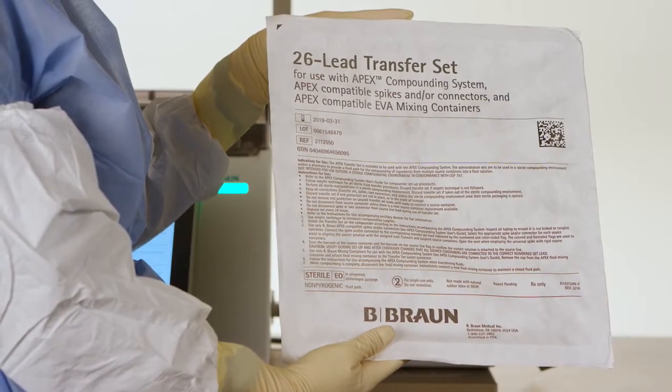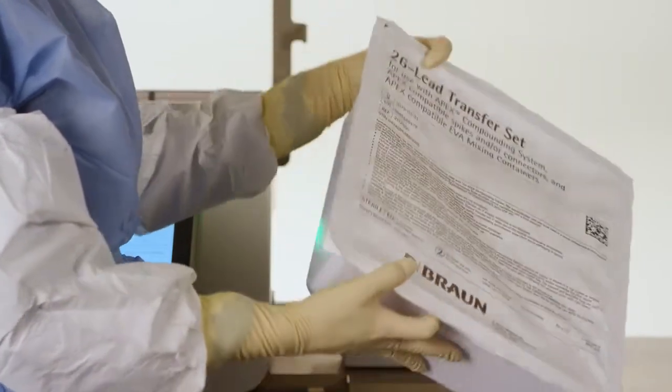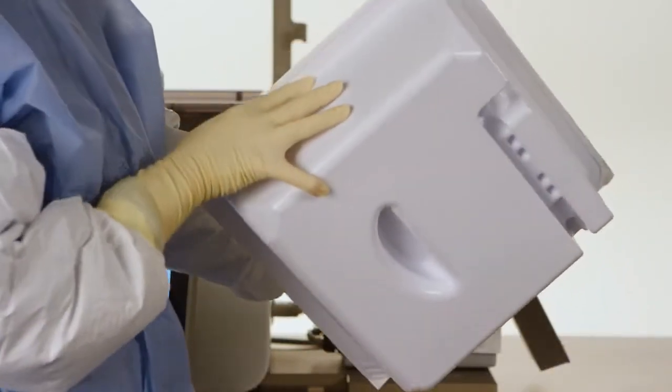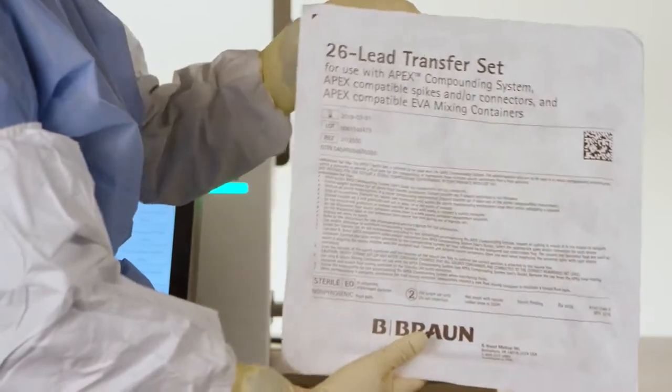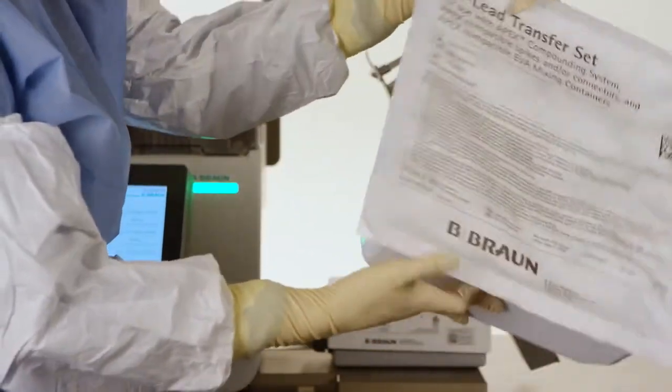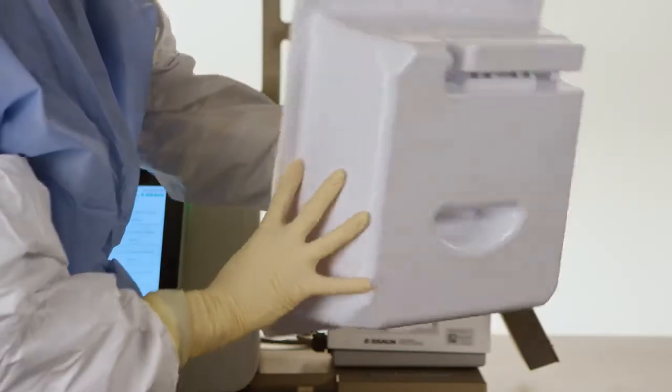Obtain a transfer set package and visually inspect it to ensure the packaging is not compromised. Check that the seal is intact and that there are no holes in the packaging. If the seal is broken or the transfer set packaging is not intact, discard the transfer set.